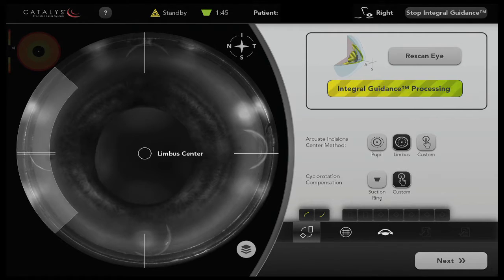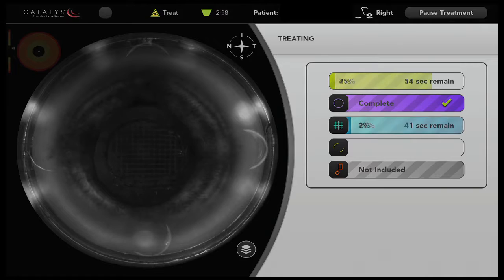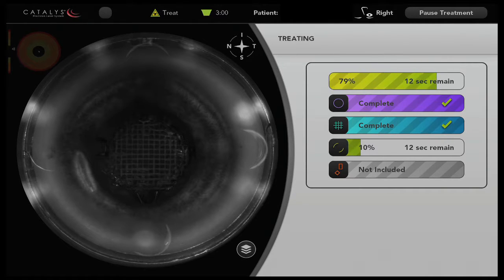And once again here, just a slight amount of manual adjustment. And then the rest of the ablations proceed very normally. You see the breakthrough of gas bubbles coming through the epithelium into the saline, and then the second arcuate cut as well.